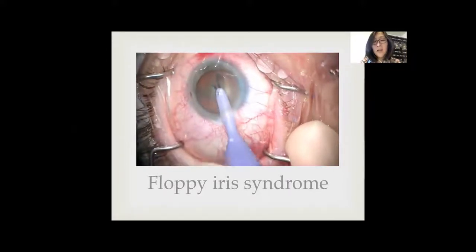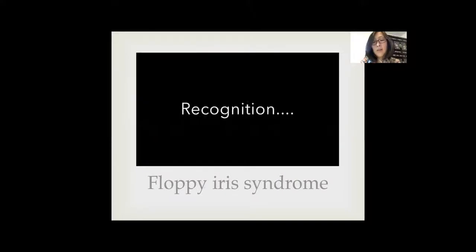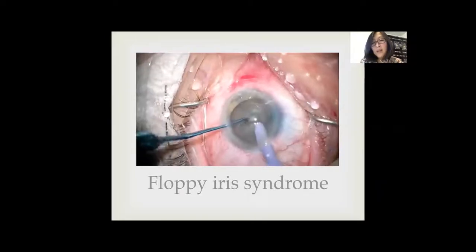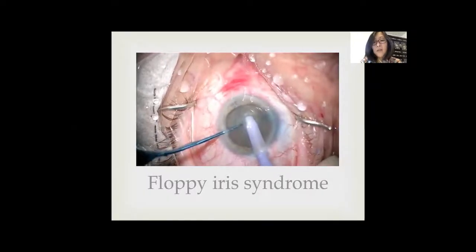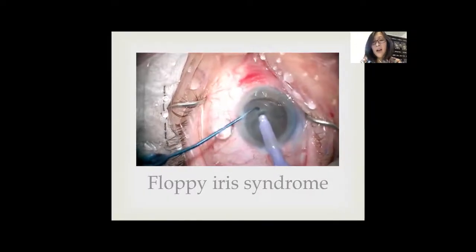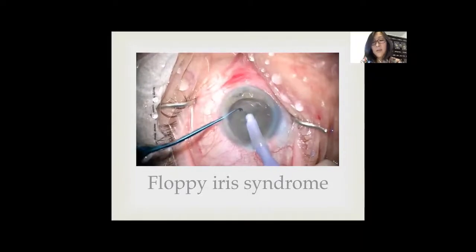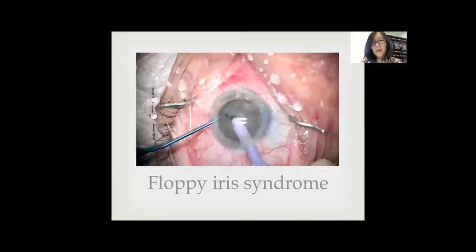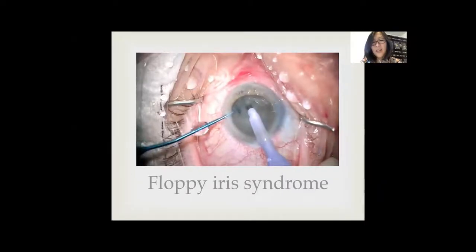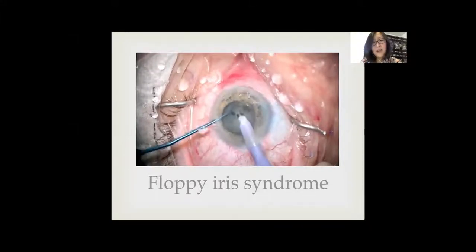So in this particular case, I know this patient is on a prostate drug. However, I've proceeded because the pupil didn't seem too bad. You can see here I've grooved and cracked. And now, as I'm starting to engage the lens, I am looking carefully actually at the pupil and the activity of the pupillary margin. I don't like the way that this is bouncing down in this particular case. I'm not paying attention so much to the fact that I can't engage the lens, but I'm looking up. That pupil is really starting to come down.